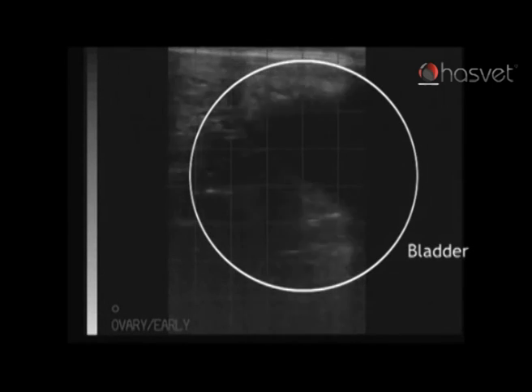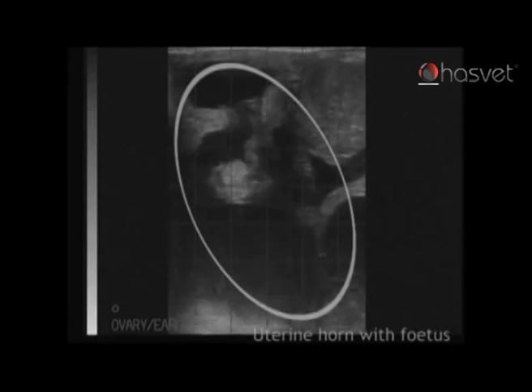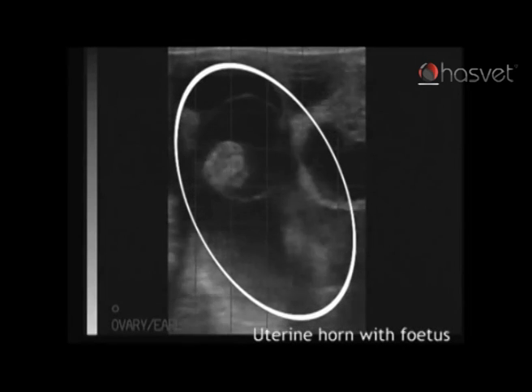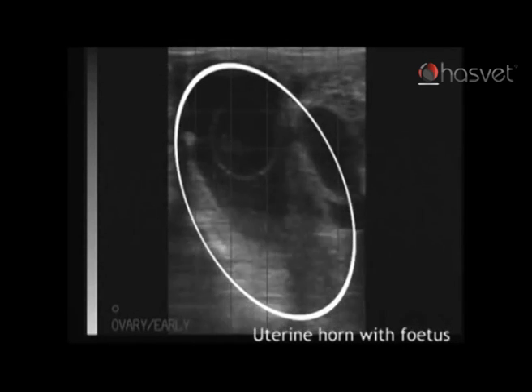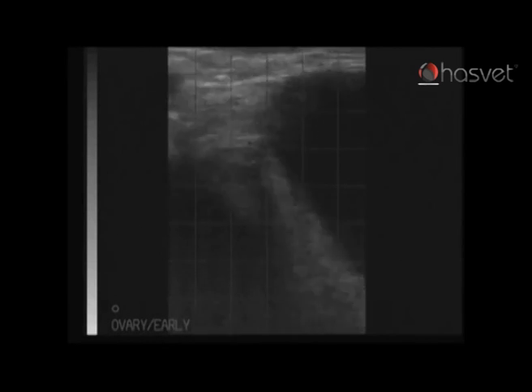We continue back down towards the bladder, which is now on the screen, and back up to evaluate the pregnancy. We can now see the fetus surrounded by the amniotic membrane. There is a presence of a heartbeat and the size of the fetus indicates that it is 37 days. We get one last glimpse of the corpus luteum as we come out.